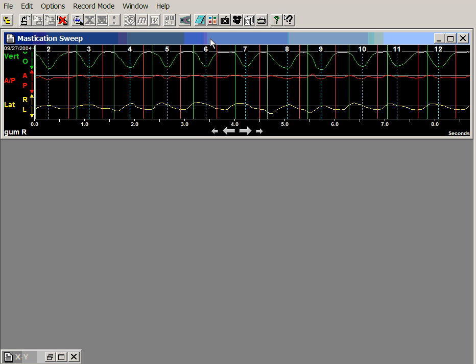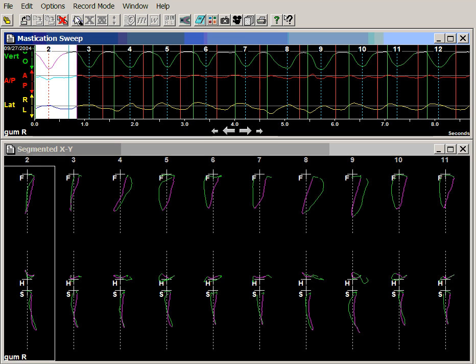If we look at the sweep view and zoom in, we can see the segmented XY view shows a great deal of variation from cycle to cycle, so we do not have consistency in the pattern of chewing.